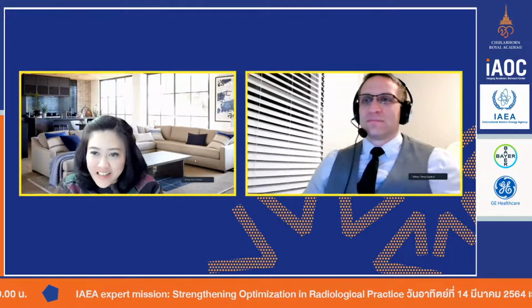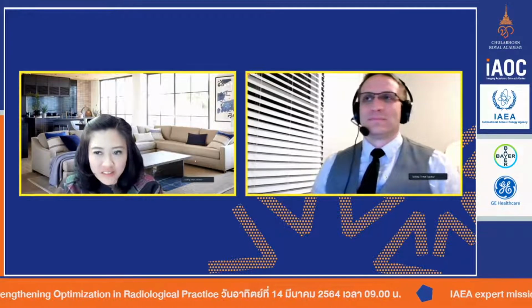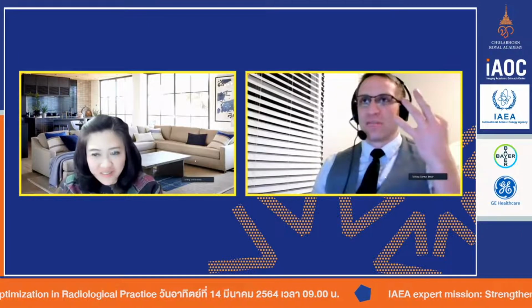So less than a second to maybe 2 seconds. I don't think it causes many issues for me as a radiologist, and in terms of image quality, it's probably not that much different. In my opinion, for those three options, image quality should basically be the same. As we talked about, what changes the way the image looks is the reconstruction kernel, the different filters we use.